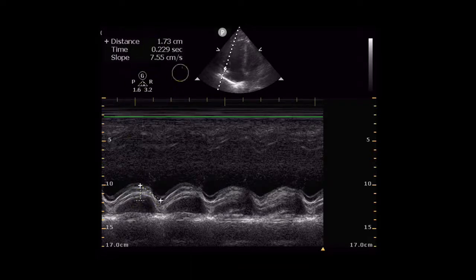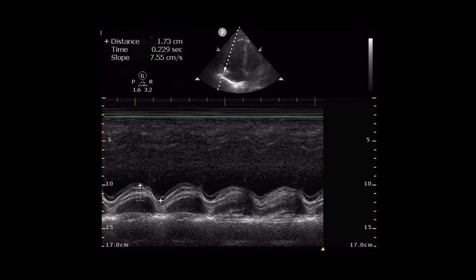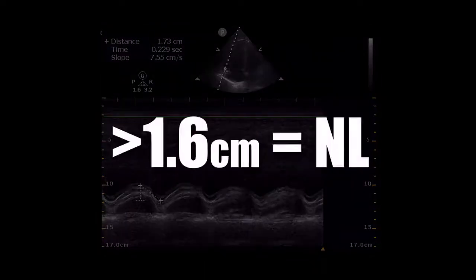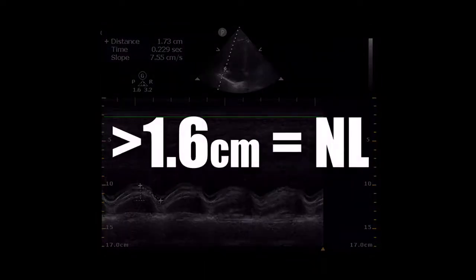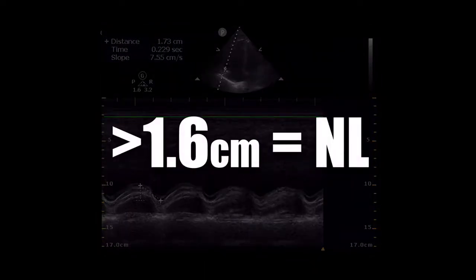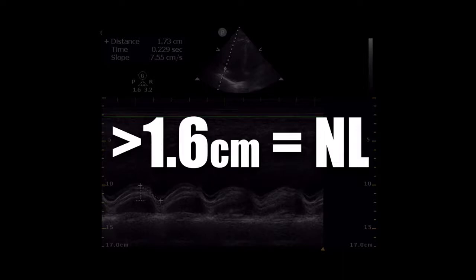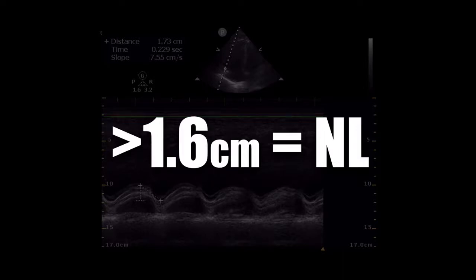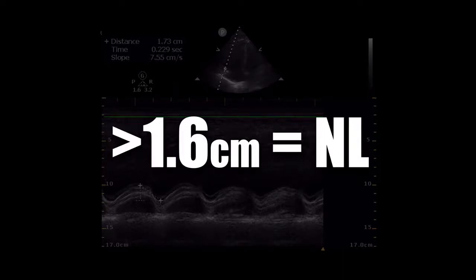This patient had a TAPSE of 1.73, which is just above what we consider normal. If it's less than 1.6, that is diminished. If it's greater than 1.6, it's considered normal. I like binary things — I like when things are just black and white, yes or no.